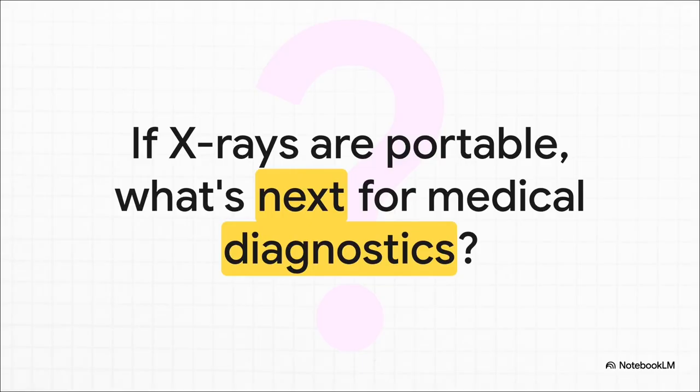And that really leaves us with a fascinating question to ponder, doesn't it? The Nomad Pro 2 proved that a critical diagnostic tool could be unshackled from the wall and made completely mobile. So it really makes you wonder, what other essential medical technology is just sitting there, waiting for its own handheld revolution?